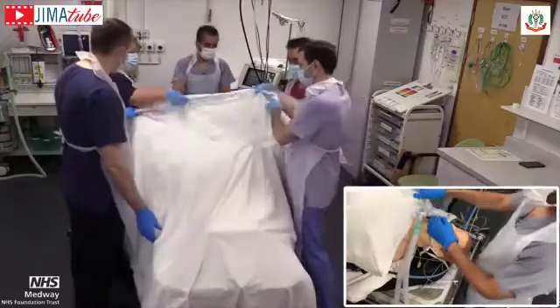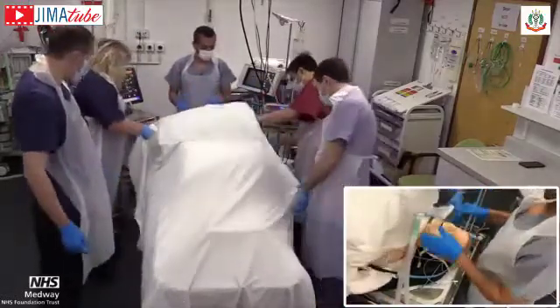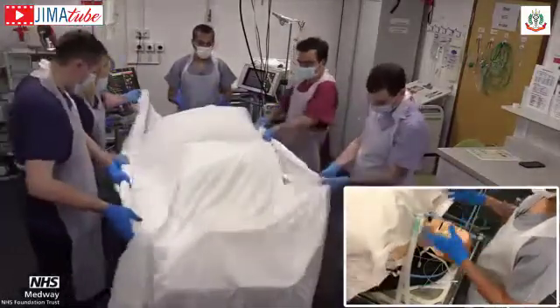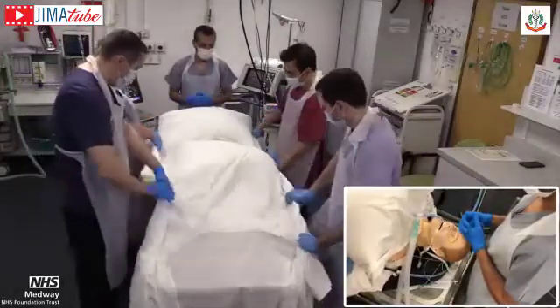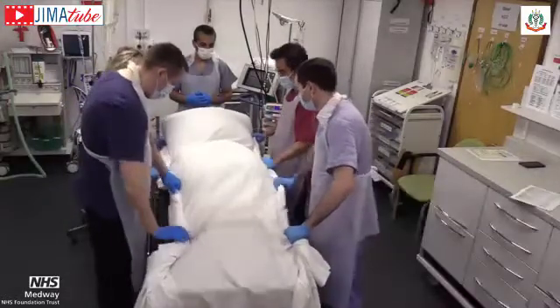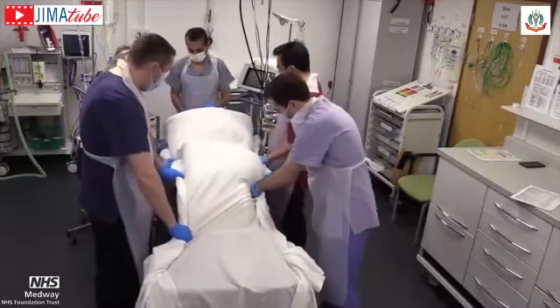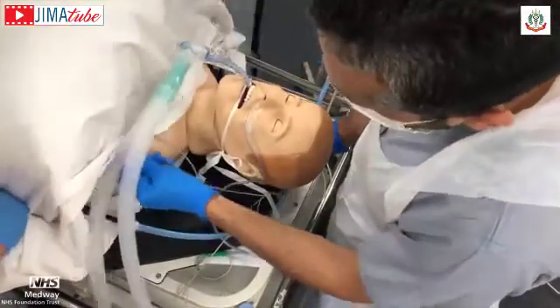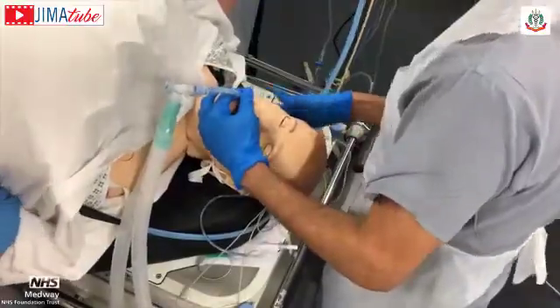Okay, after keeping the pillows, we put a bed sheet on the patient, and then between 2 bed sheets, we make a quick, well-packed bundle. So we are rolling the edges of the sheets to make sure that we have a good hold of the patient and all the pillows, so that nothing moves. And we are making sure that everything else is secure and safe, and the patient is still as stable as he can be, and the airway person has to be happy.